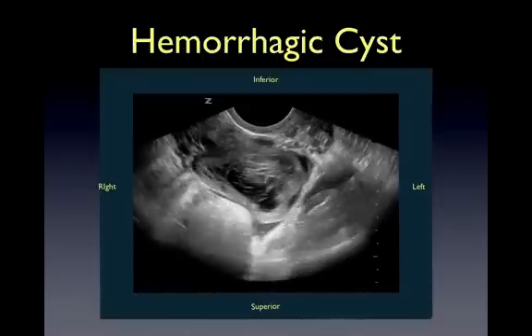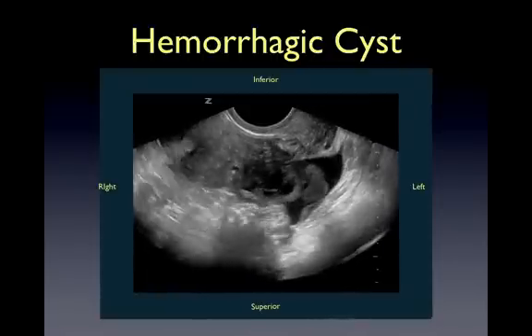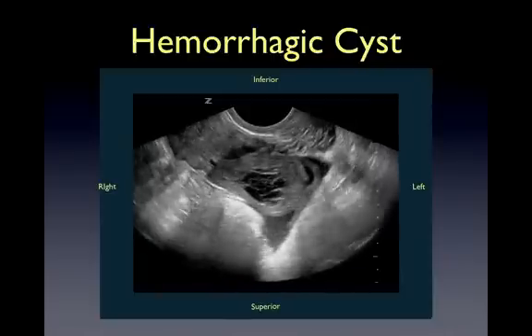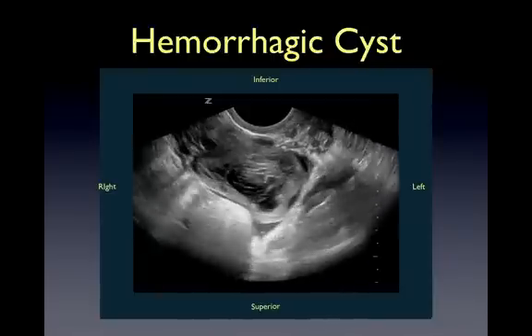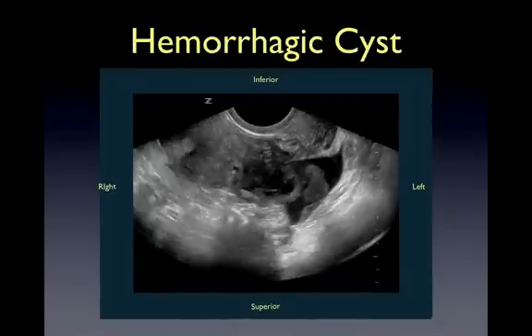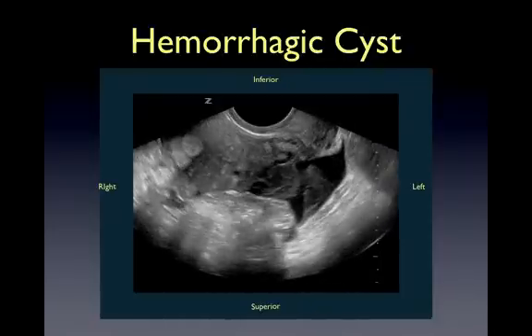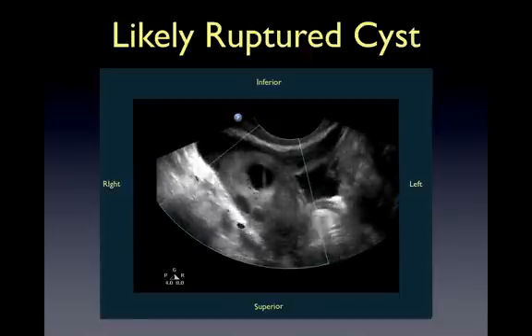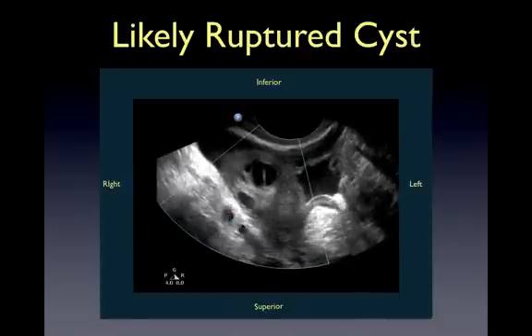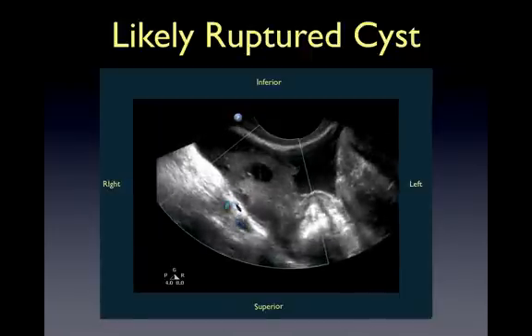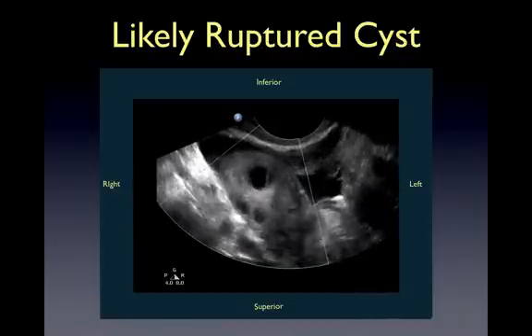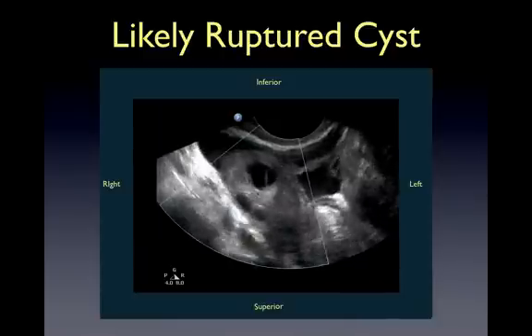Here is an example of a hemorrhagic ovarian cyst with heterogeneous echoes within it. Notice also the echoes surrounding the cyst, likely representing clot. This clip from a non-pregnant female with right lower quadrant pain shows a small complex cyst of the right ovary with surrounding anechoic fluid. The fluid may represent a ruptured cyst or may be the result of ovarian torsion.